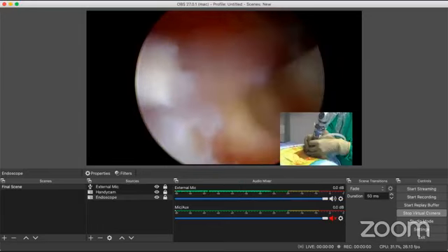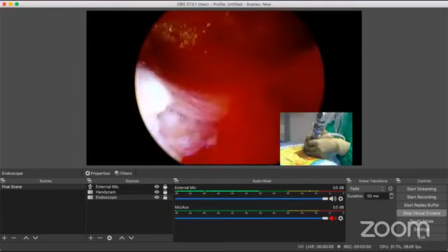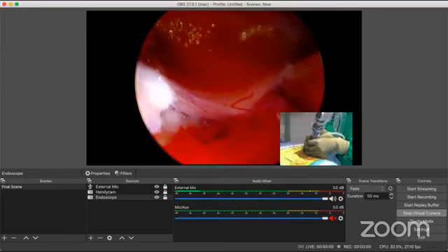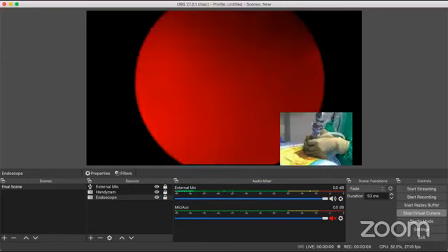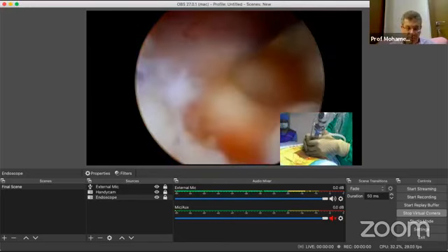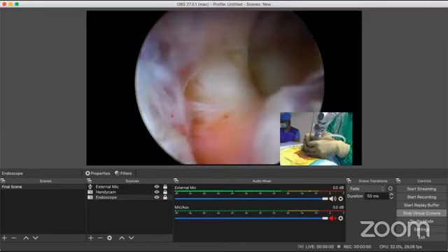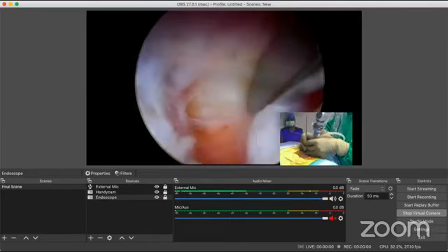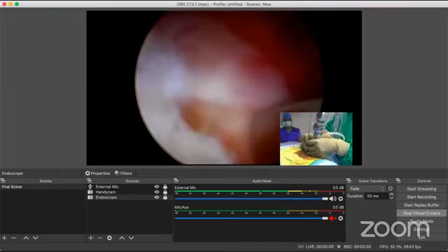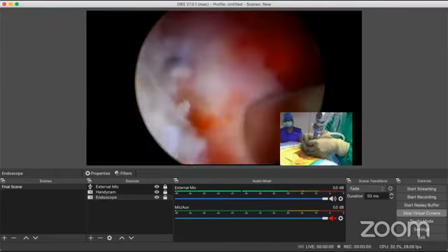You see I'm pushing into it, it doesn't go in. I'm sorry. You can see the entire osteophyte. And there's nothing I can do about it over there. I know for a fact that I've decompressed the nerve very nicely. The nerve root is totally free.